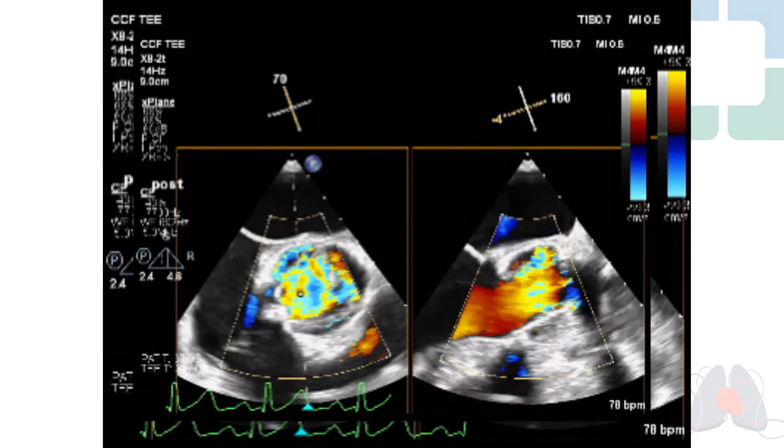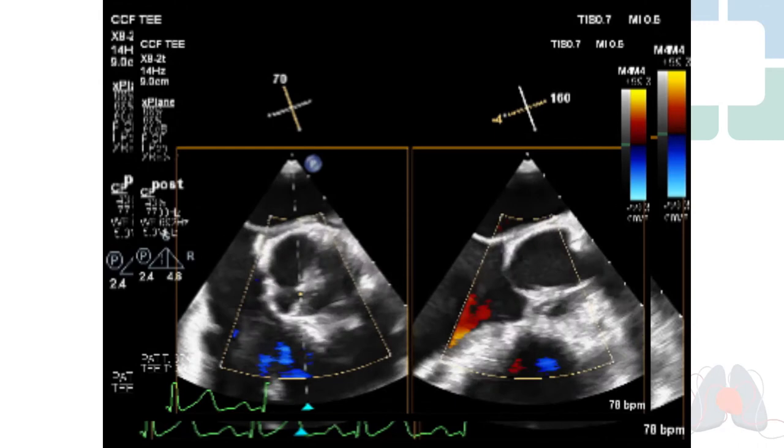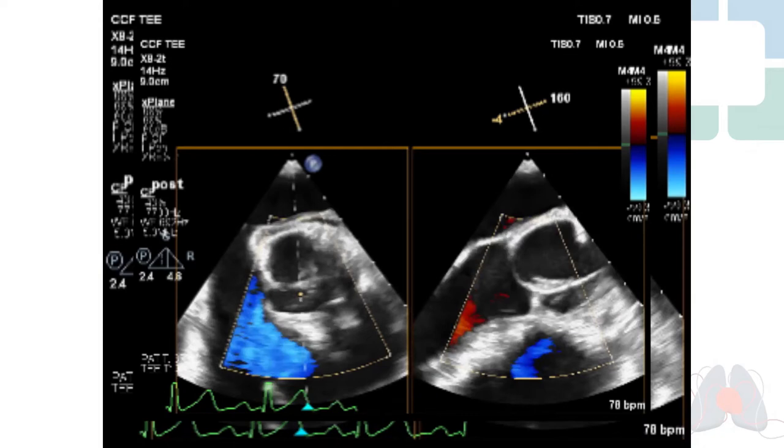Don't abandon the valve because over time, as the inflammation is absorbed, that seems to improve. Obviously, if you've got severe stenosis, that's not a valve you should be keeping — you shouldn't have made it so tight. We will then go ahead and show how this repair can be used for a remodeling operation.